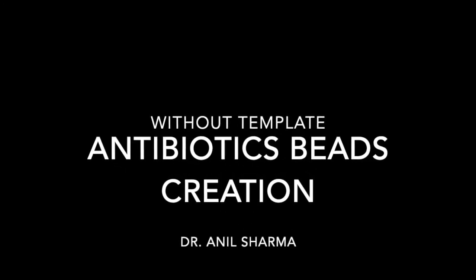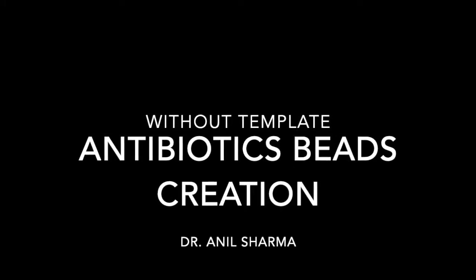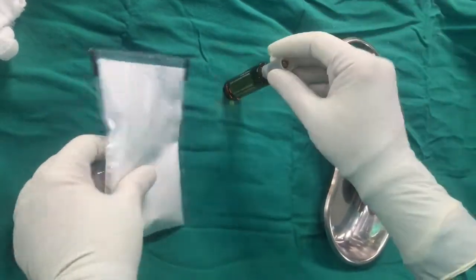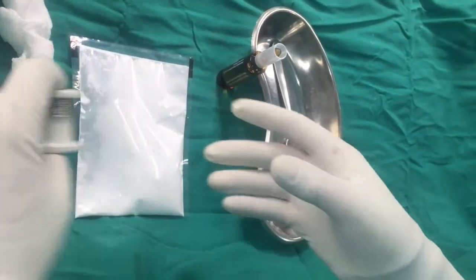Dear friends, in this video I will tell you about how to make antibiotic beads without templates. To make antibiotic beads we need a cement solvent, cement powder, one kidney tray or any bowl, and one SS wire to hold our antibiotic beads.